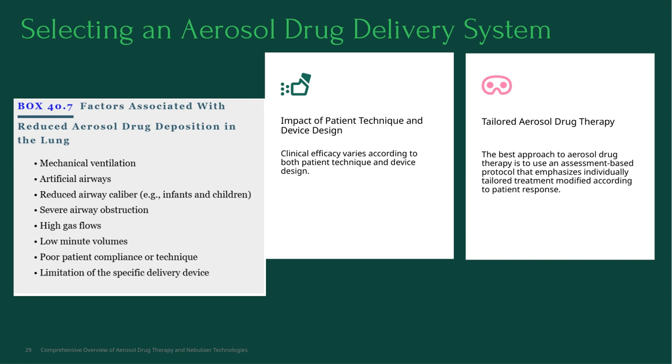This means we evaluate each patient's unique needs and responses and then modify the treatment accordingly. Personalization is essential to ensure the best possible outcomes. Finally, selecting the right aerosol drug delivery system is a critical step.